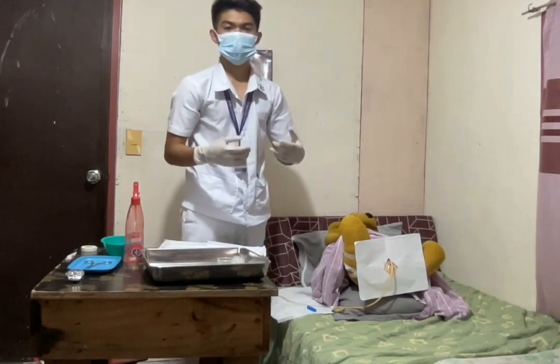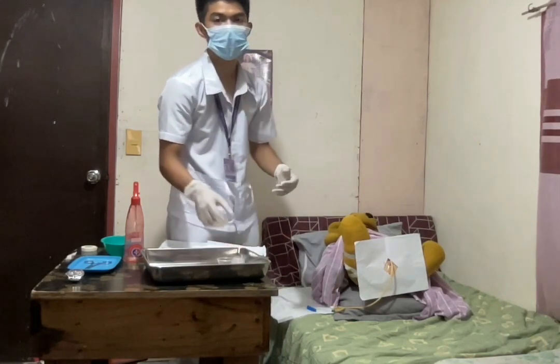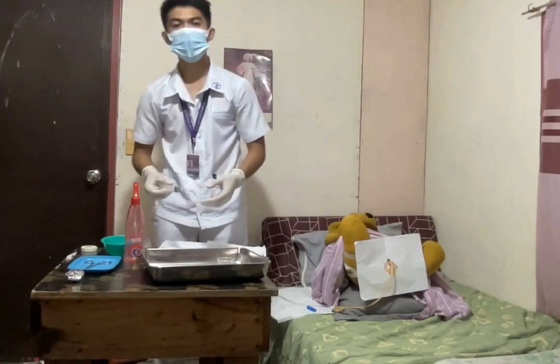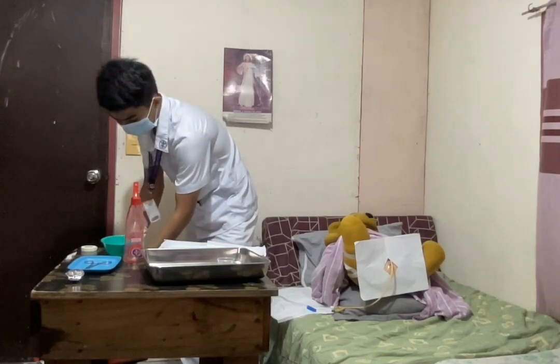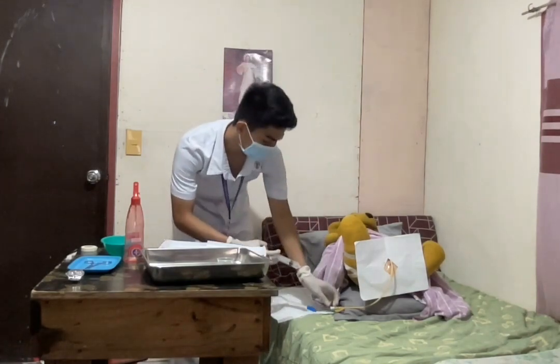Then, inflate the balloon with 10 to 15 cc of sterile water using the 15 to 20 cc syringe. This is to secure the catheter in place and prevent its removal. Then we're going to inflate the balloon.